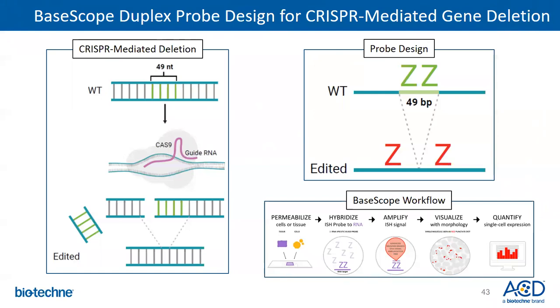Yeah, we actually have a couple of webinars that go into this in great detail. We typically do an H-score for different sample types, and then across your study. I can send the link to some of those as well. But you're right. One of the nice things about getting morphology is you may see very different areas of expression, like in this tumor, and you'll be able to quantify with a relative expression. In addition to those webinars, Halo is a software that a lot of people use. We have an ImageJ tech note, so if you have Fiji, you can use that as well.